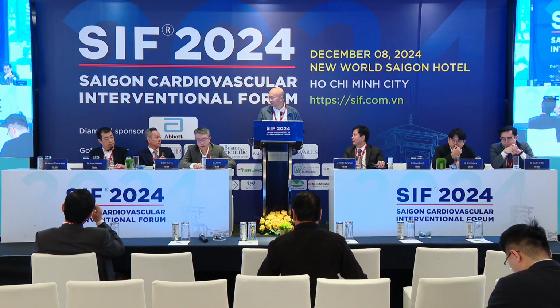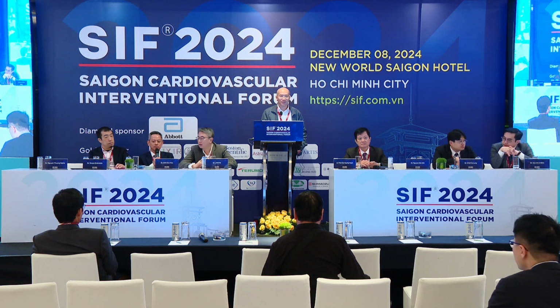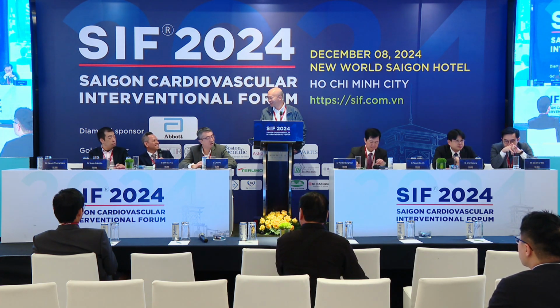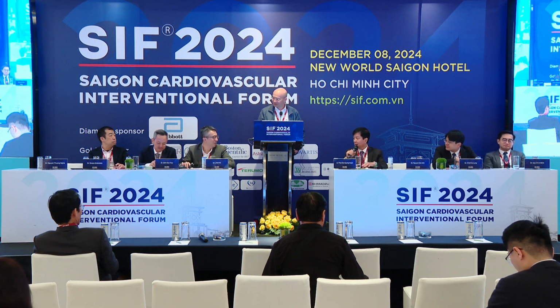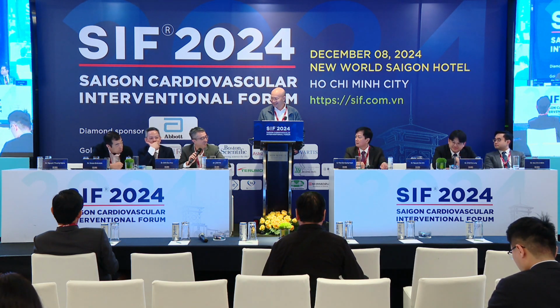Okay. And Dr. Huy? Yes, I think IVUS and OCT now must be a part of left main interventions. OCT is not available in most hospitals in Vietnam, and we are still in the learning curve of how to use OCT for left main. IVUS is more familiar, so I think now IVUS is a must. If you want a good result of left main PCI, you should not base only on angiography. And Professor Lam Ho, do you prefer IVUS or OCT for left main PCI? For left main, definitely I will choose IVUS. Honestly.